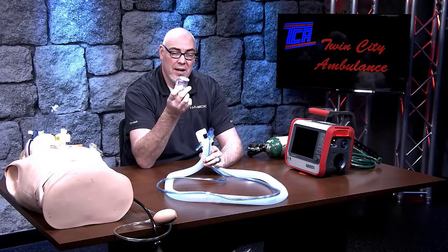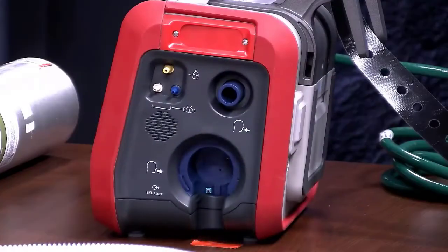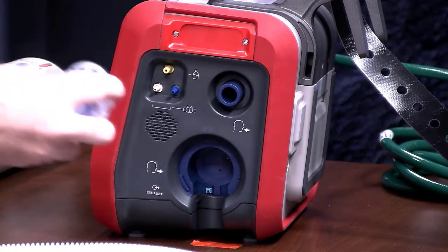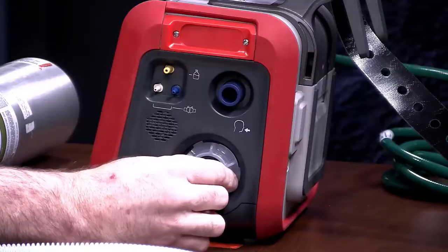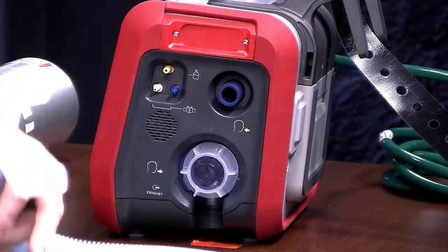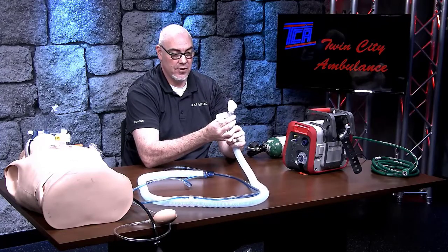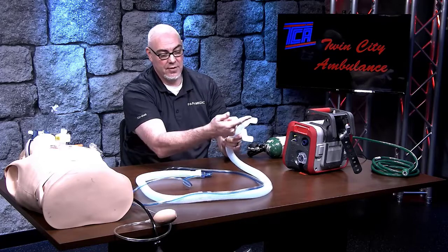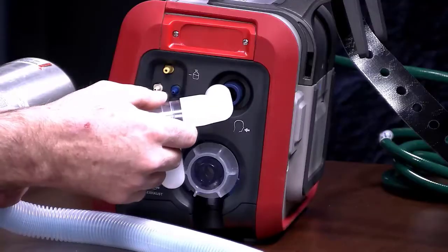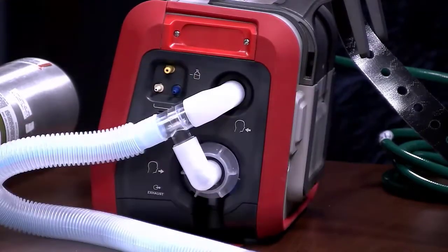You'll also have an expiratory valve that comes with this system. To hook up, look at the side of the vent — take your expiratory valve connector, plug it in with the valve facing down, and then rotate the entire thing clockwise until it locks into place. Next, you're going to see a dual port on the tubing for the patient circuit. The best way to remember this is that it makes an arrow, and the arrow is going to point towards the front of the vent when you hook this up.